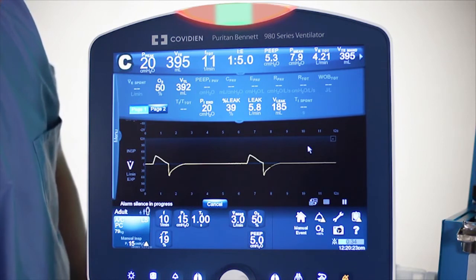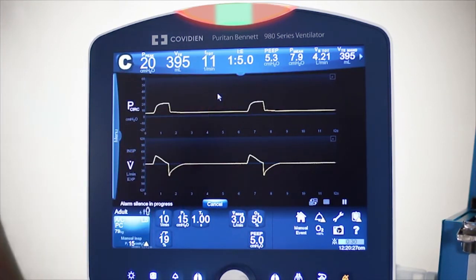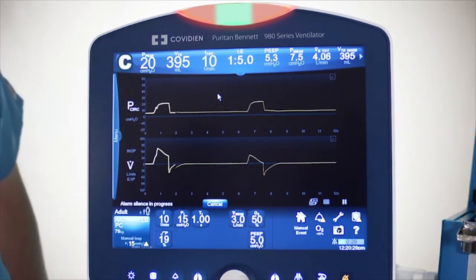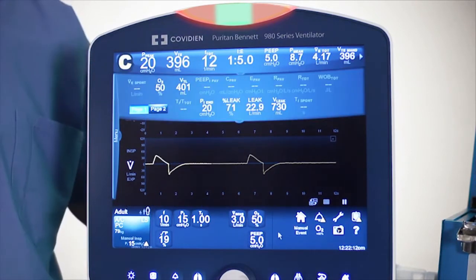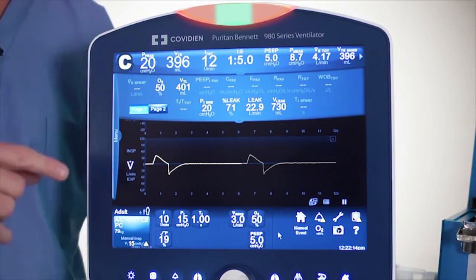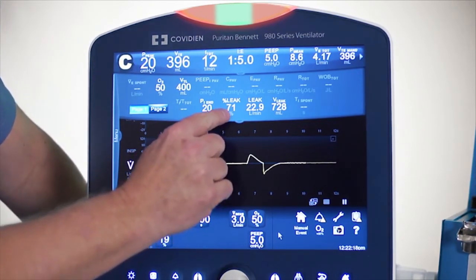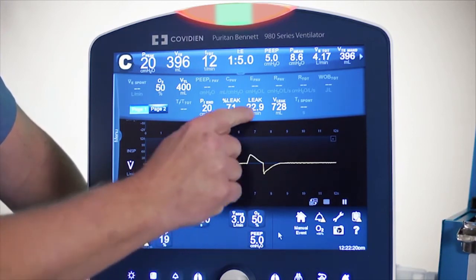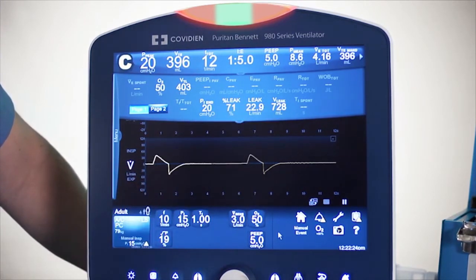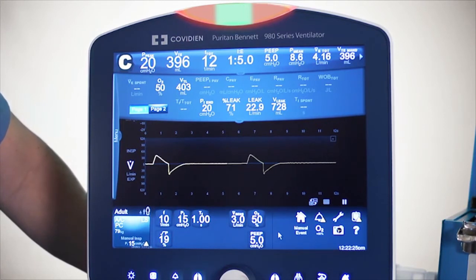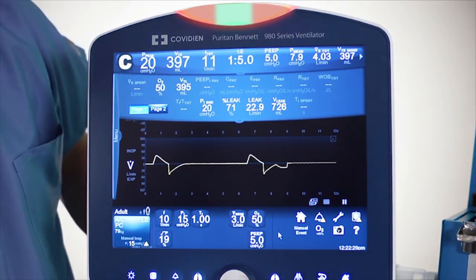I'm going to push this up so you can see how fast the software works. Now I've got a really big leak going on, and it captured the leak that quickly. Now the parameters displayed show a leak of 71%, a total of 22.9 liters per minute, as well as 728 milliliters per breath. I'm going to go ahead and close up this leak as we move on to another part of this demonstration.